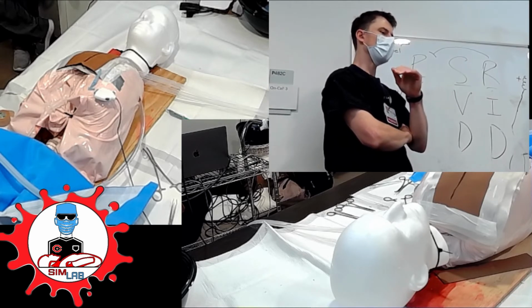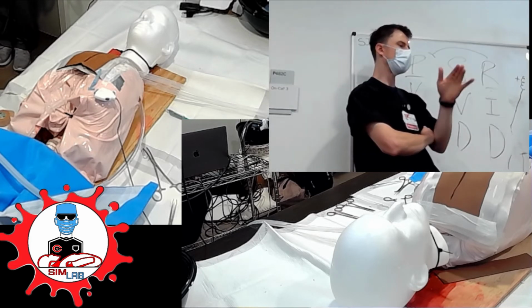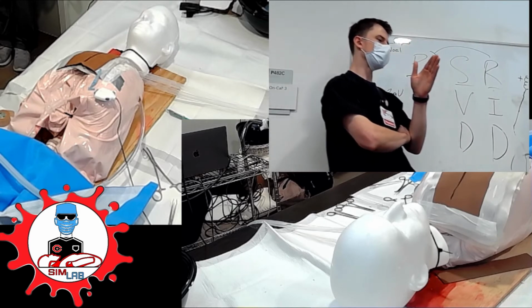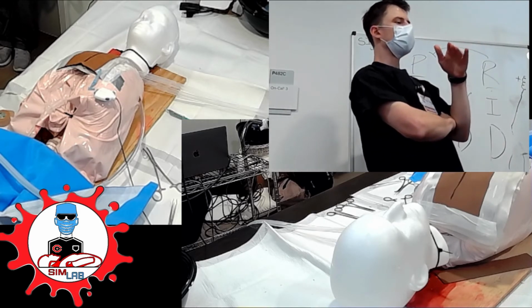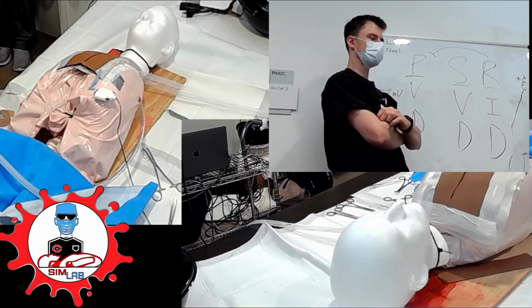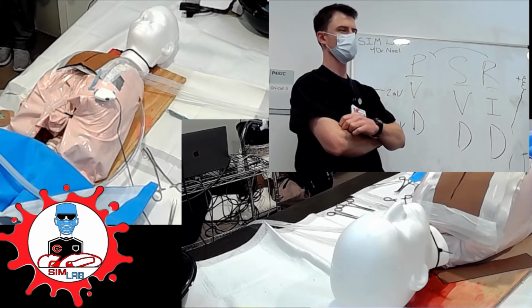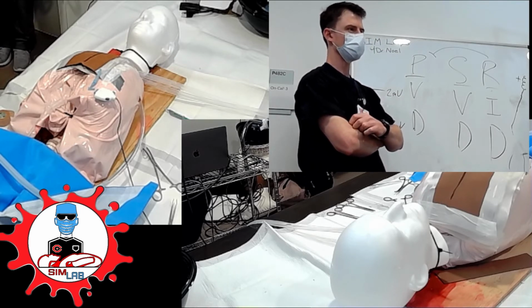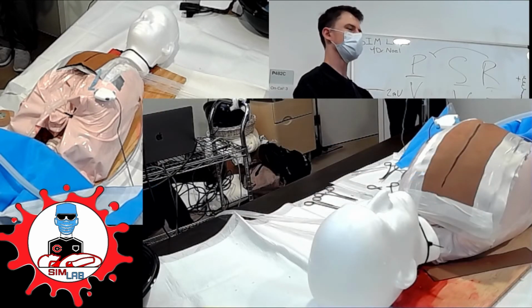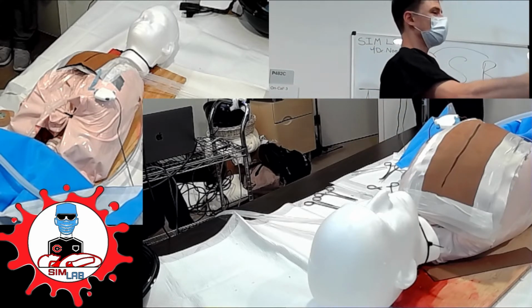Okay? All right, so you shock 3 times. They're now in, it looks like sinus on the monitor, and their blood pressure's 30 over 10, undetectable. And no pulse? No pulse. Considering PEA, so I guess we start chest compressions, CPR. Okay. And we'll probably have to open the chest. Yeah, so open the chest, right? This is the patient that we need to open the chest on. It's indicated really up to potentially 10 days.